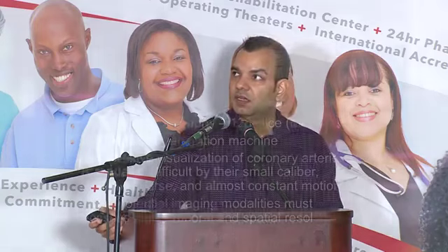I would say 30 years ago, in the 70s or 80s, when CTs initially started, there were single slice rotations, one slice per rotation. And we have moved to 128. Actually, there's even a 320 slice CT in the market. But for all practical purposes, 128 is very, very good.